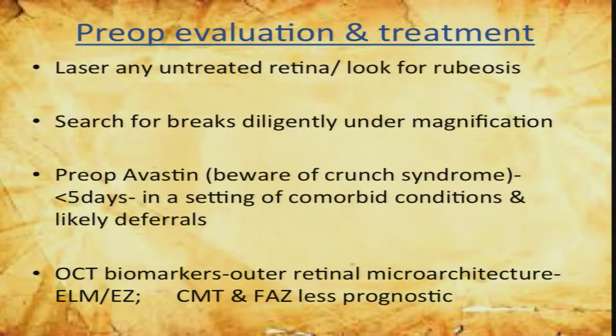What about the preoperative evaluation in these patients? One must carefully look for rubeosis, and laser any untreated retina, because that will make the surgery easier and shorten the surgical time.